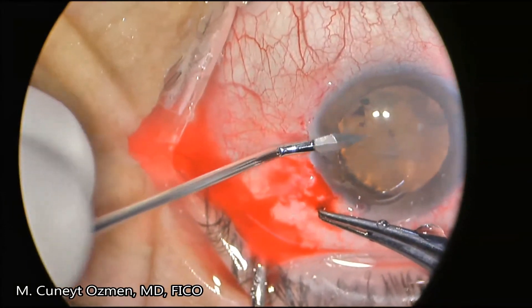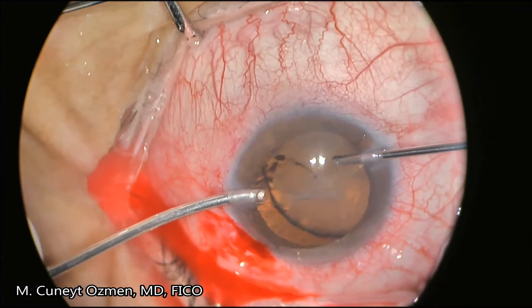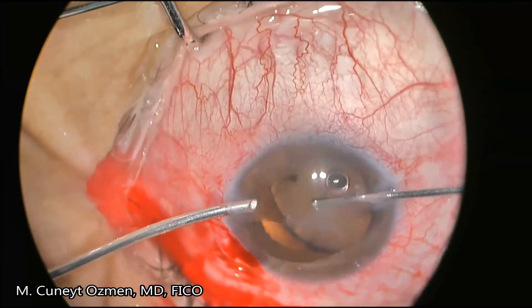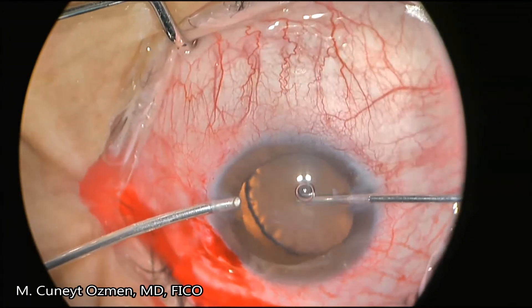Next, I'm entering the anterior chamber with a 20-gauge MVR knife and start doing a vitrectomy. During this procedure you will see how unstable the lens is — the lens has more than 180 degrees of zonular dialysis.